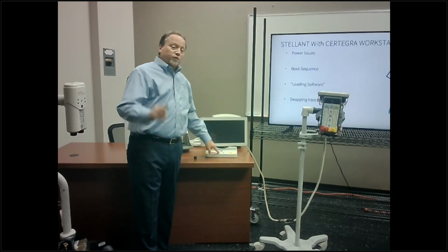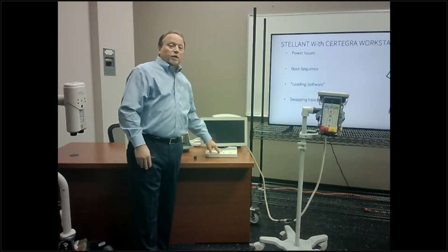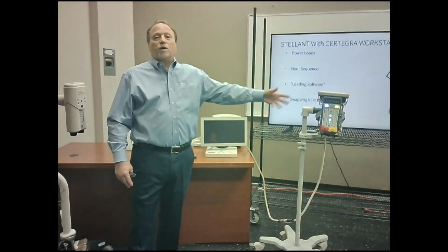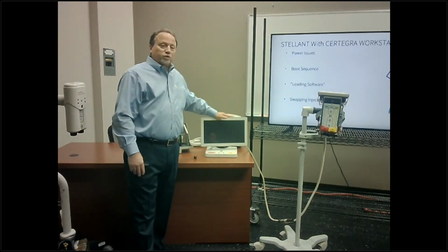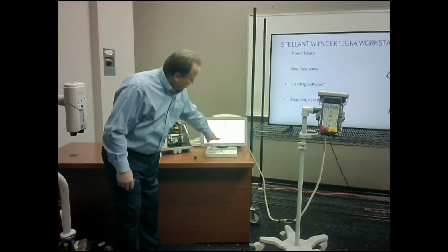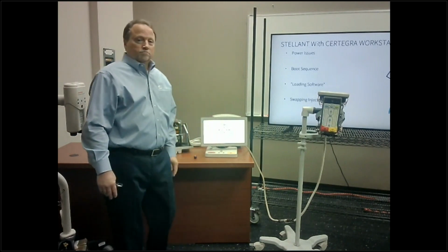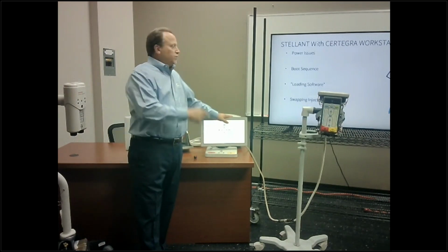To turn this on, it's very important to watch the boot sequence. If you don't watch what's going on or understand what it's doing, you can get very confused. So you hold the amber button down for about 2 to 3 seconds. It's going to boot up, you're going to see the lights come on, you're going to hear the noise, and it's going to start booting into Windows. As it boots up, you want to watch the screen. You'll see down here it's red, it's black. It's talking to the head. When it actually makes communication to the head, it's going to turn red, and then it's going to boot up. If it sticks at loading software, it's never communicating.